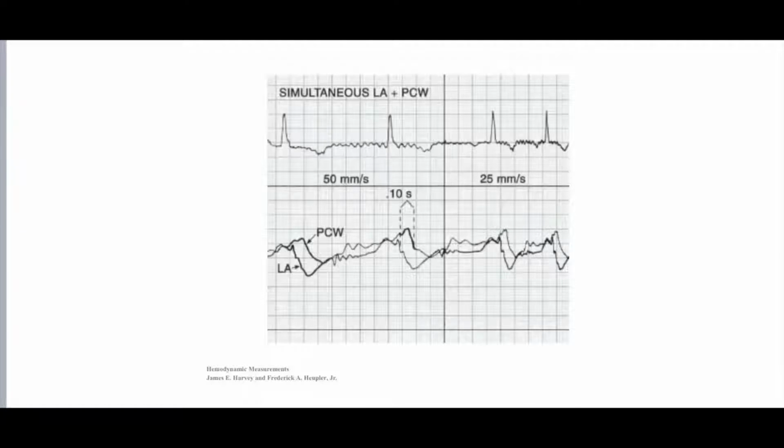Look, you can answer from the tracing here. This is left atrial pressure tracing and wedge tracing for the same patient. You see, there is probably not much difference in the baseline figures obtained. The mean pressure, the peak pressure might be equal, but the difference is in timing.